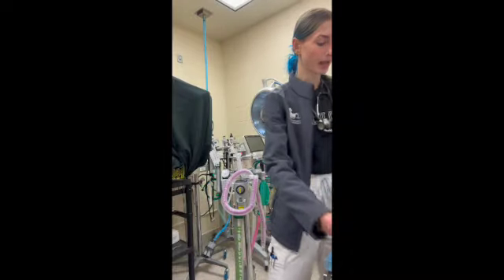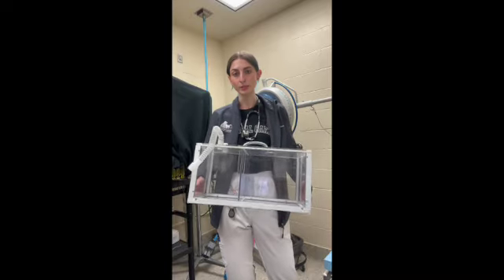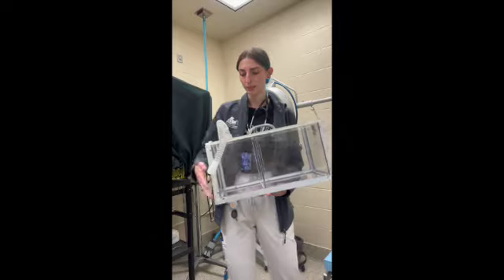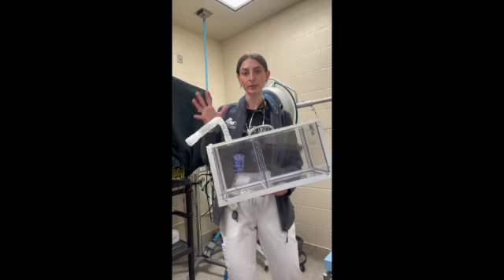And then we also have our anesthesia chamber, and this is for any kind of fractious patient or smaller patients, any kind of exotics or wildlife. You can actually connect the anesthesia machines directly to these ports and then lock it so that no air escapes.